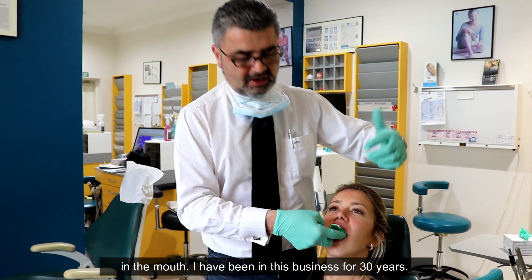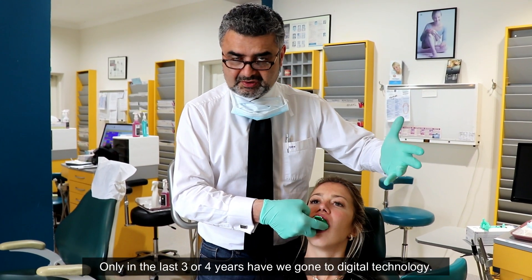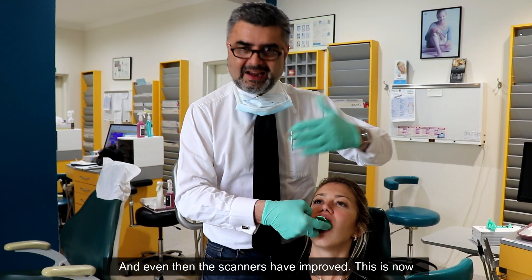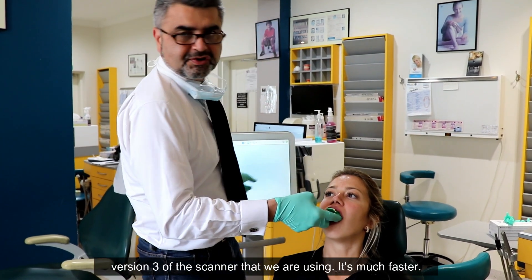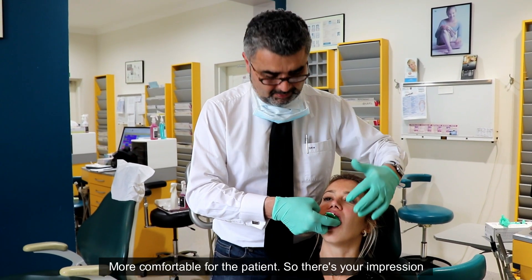I've been in this business for 30 years. Only in the last three or four years have we gone to digital technology, and even then the scanners have improved. This is now version three of the scanner that we're using — it's much faster and more comfortable for the patient.